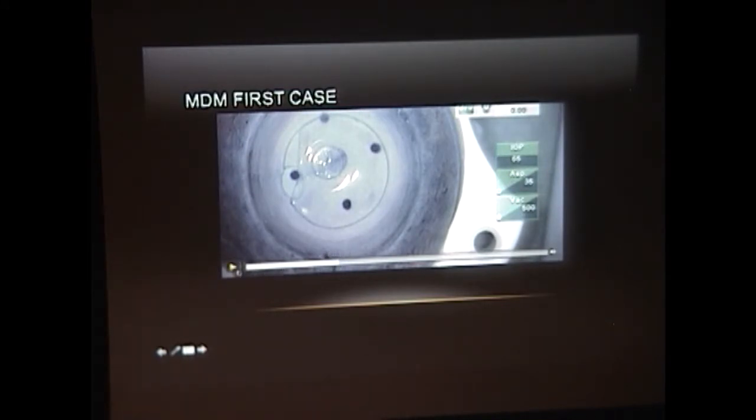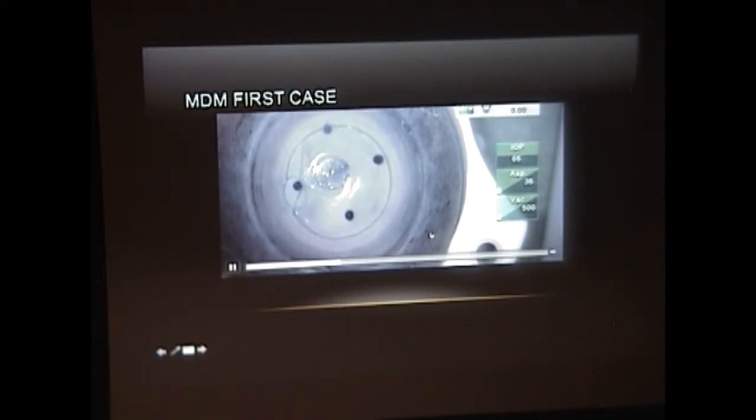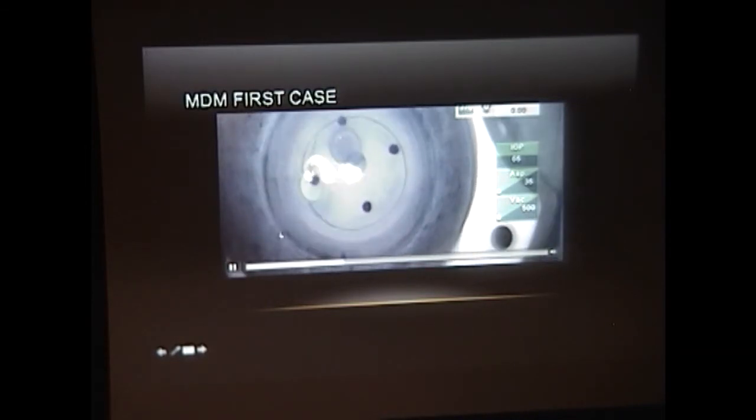That's a little stromal button that used to be in that opening there, and that's where the eye bank had removed a piece of stroma to put the S stamp on this graft, which unfortunately is not very visible, but that's what that came from. And because of where we had trephined, it had kind of come around. It ultimately won't prove to be much of a problem, but that was one thing we noted that we could have avoided in this case.